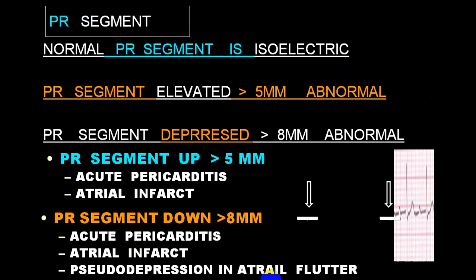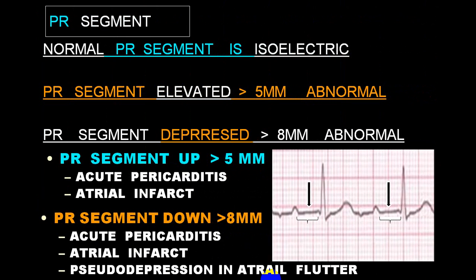Now I'm just putting up one slide, which gives you a little idea regarding the PR segment. What is the PR segment? The PR segment is usually isoelectric.